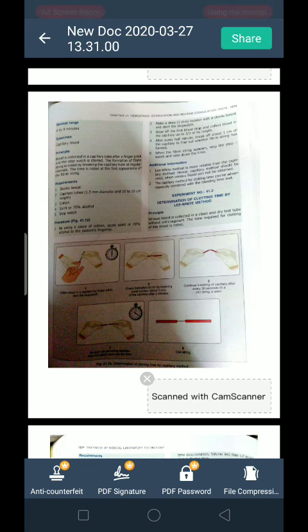Now another method in which we use the test tube, this method is known as the Lee-White method, and the principle behind this method is the same. When blood comes in contact with the glass surface, it will form a clot. ये क्लोट बना देता है जैसे ग्लास सरफेस की टच में आता है.